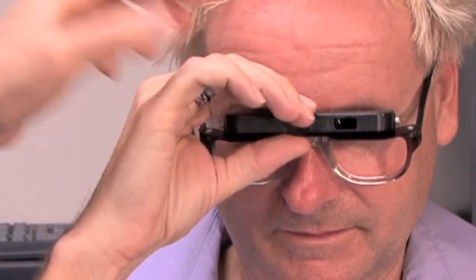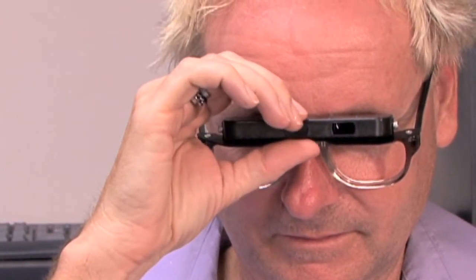Then we ask the patient to reach up to change the focus so that when they look through the telescope it's nice and sharp. So when you look straight ahead, you use your normal prescription, and when you need the magnified vision you dip your head down.